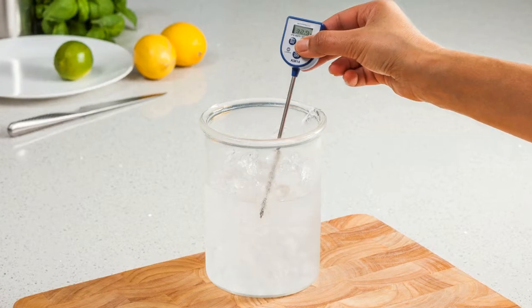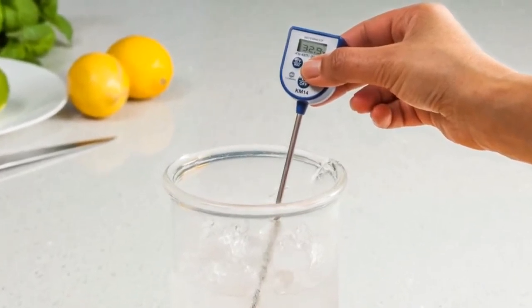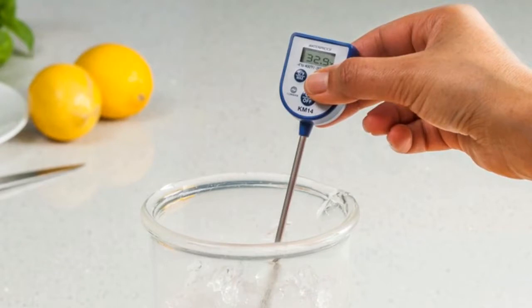Now you need to wait for the reading on your thermometer to become stable. We would normally expect a reading to show that is within 1 degree of 0 degrees Celsius or within 2 degrees of 32 degrees Fahrenheit.